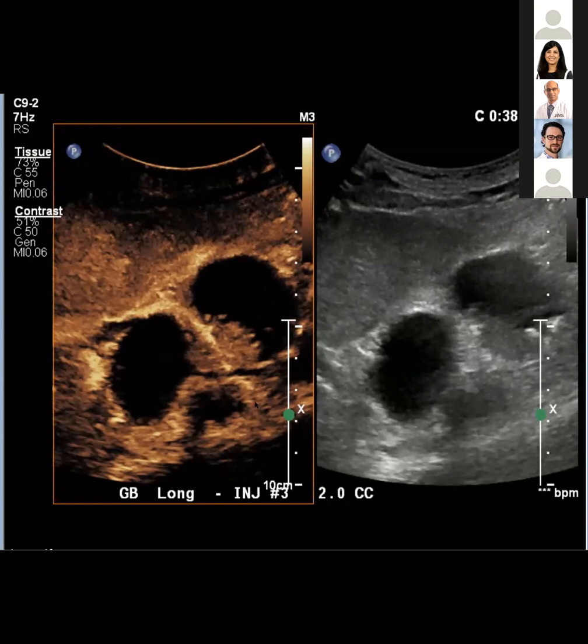David, I have a question for you. For adenomyomatosis, how it can enhance, I think because of the muscular hypertrophy. Would you, on contrast enhanced ultrasound, see a different pattern of enhancement if you have a dense adenomyoma, like in the fundus or something? Yeah, that can be a little more difficult.